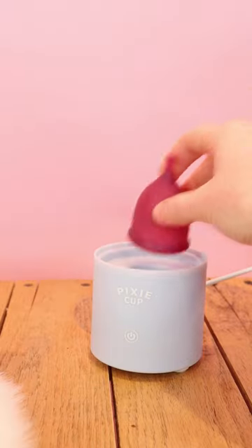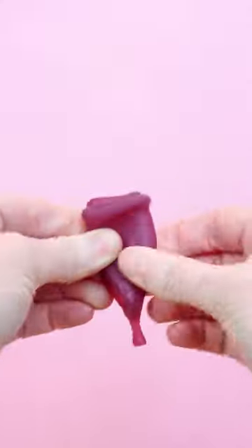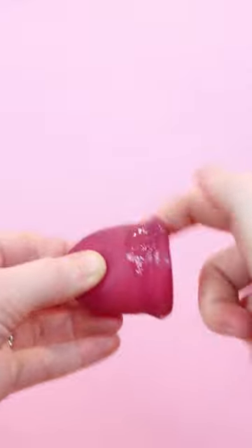How to insert a menstrual cup. First, you want to sterilize your cup and wash your hands. You can use the c-fold or the punch down fold. Add a little bit of lube for a painless insertion.